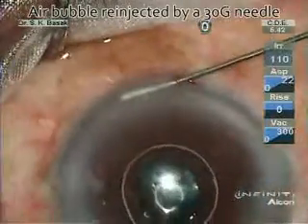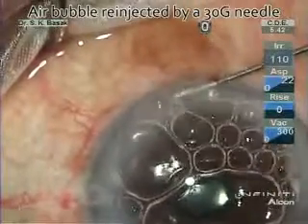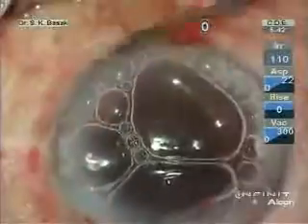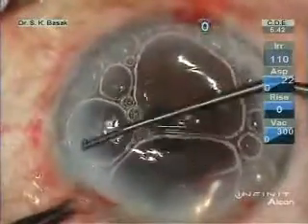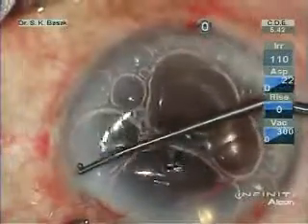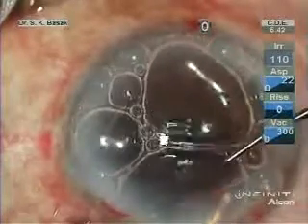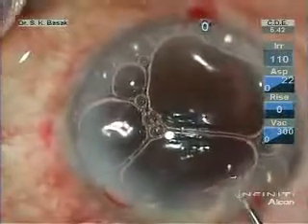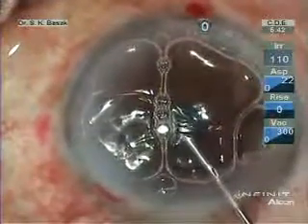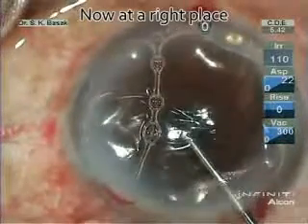Air bubble was again re-injected from 6 o'clock position via 30 gauge needle. Now the air bubble was in right plane.